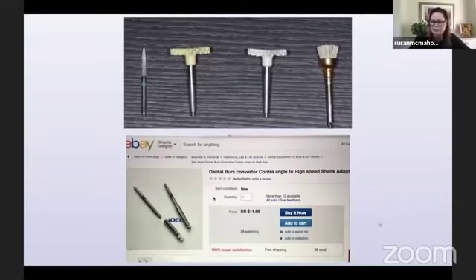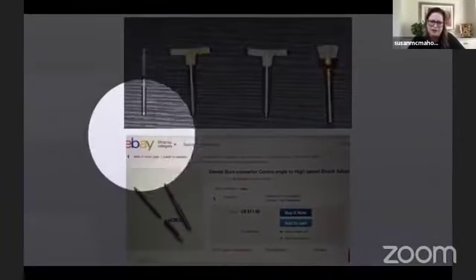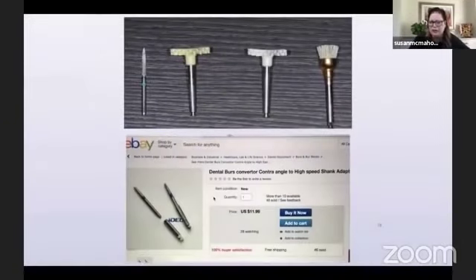So they're really inexpensive and you can put any burr in there because you'll use the same technique on posterior restorations. But instead of using kind of a modified flame like this, you can use a round burr back there and polish composites in the posterior the exact same way and get teeth that absolutely disappear.